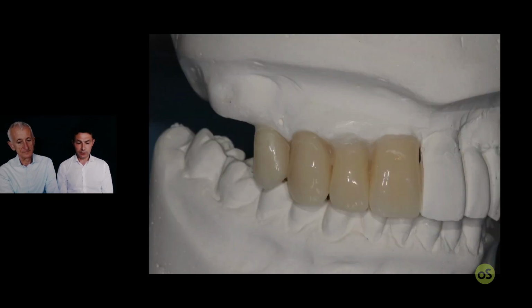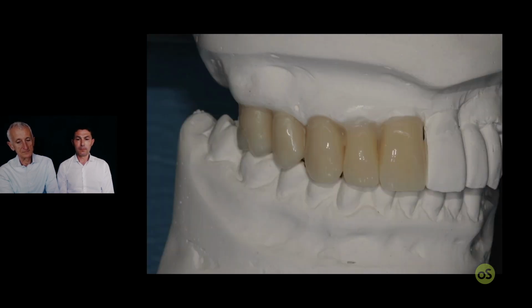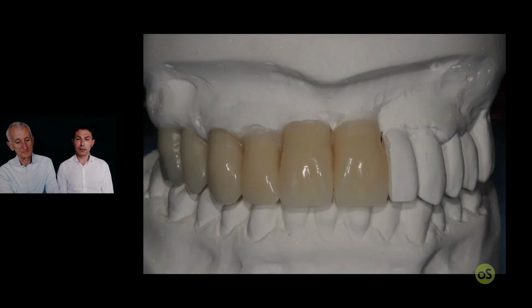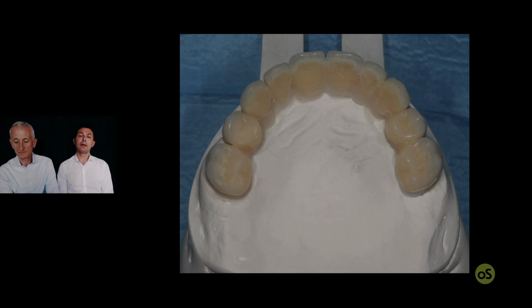Only 10 teeth, because the patient has 10 teeth now and 10 teeth after the surgery, for sure. One side of the setup is ready. Now with the same approach, start the other side. And now the setup is completely ready.